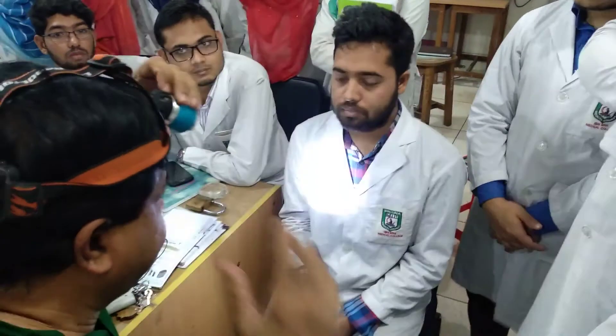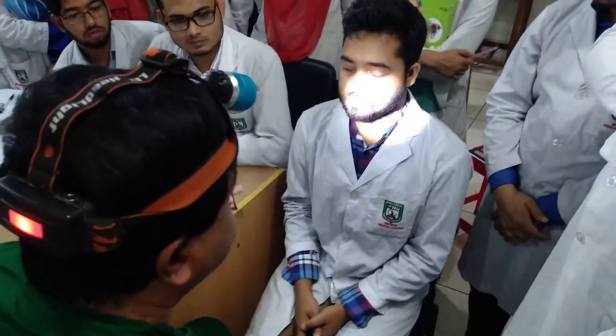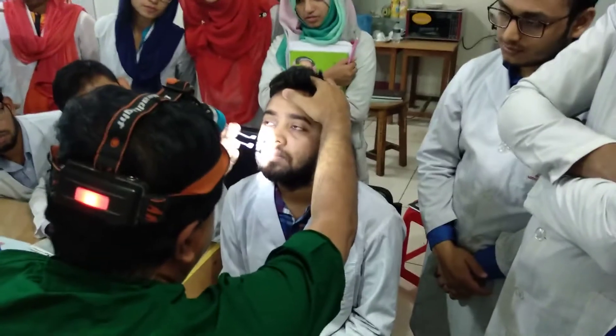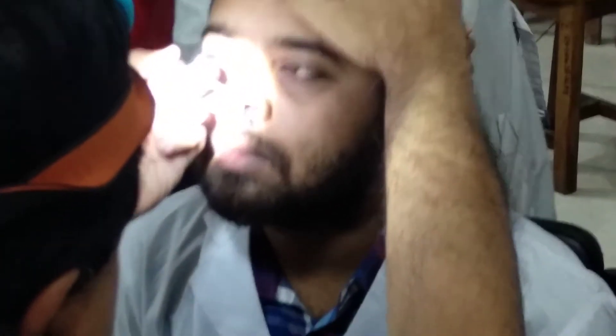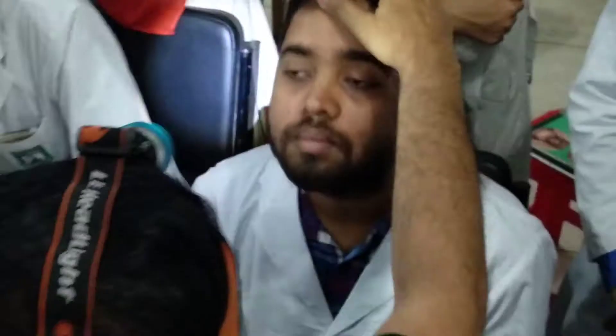Smell and patency — smell and patency first. Let's take a look at this one. Let's fix it and take a look. The floor, the roof, the middle one, the lateral one — what do you see? If you look at this one, you can see it. We are closing, but we are closing.